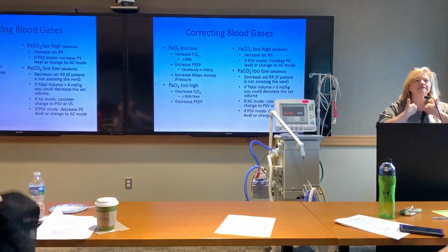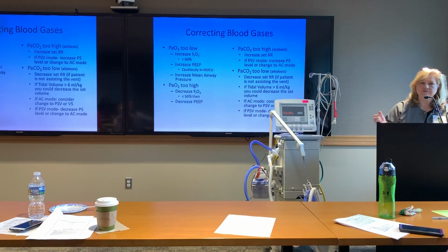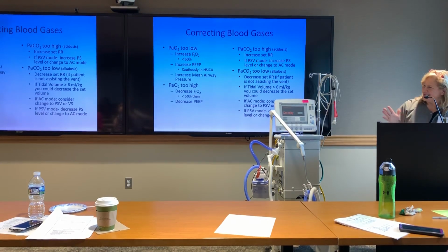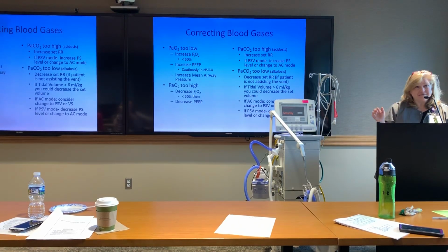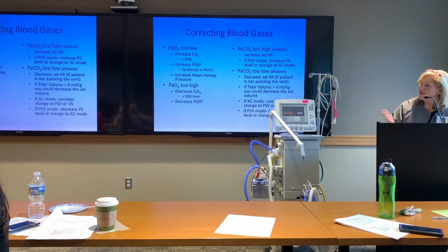Neuroscience, obviously, because it increases intrathoracic pressure, which impedes blood return to the chest. So that's going to cause some trouble, so you want to use that very judiciously. Different guys have different feelings on it, but higher FiO2s are also damaging to the body. Anyway, increasing the mean airway pressure is another way to do it, and we can do that with inspiratory times as well. If your PO2 is too high, then you just do the opposite of those other things.